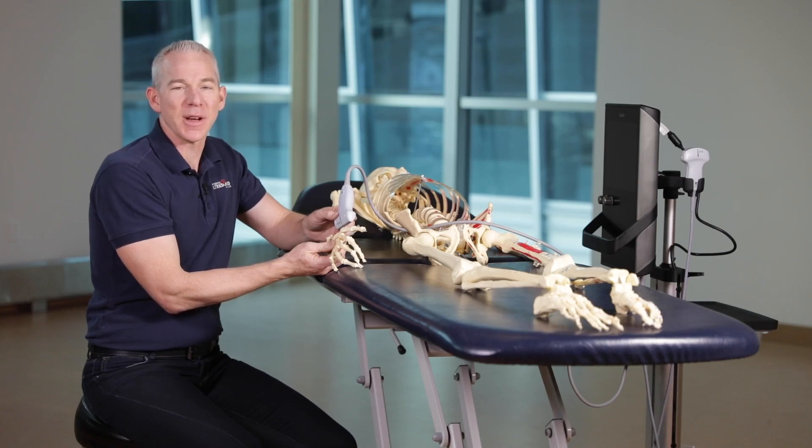Hi, Dr. Frank Johnson from Sport Medicine Ultrasound Canada. I'm going to show you how to scan the CMC joint of the thumb.